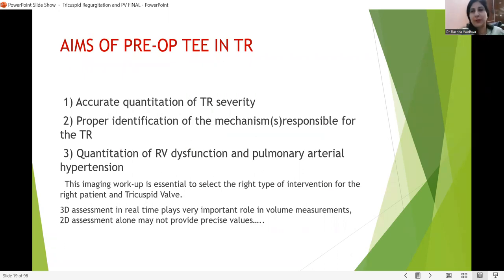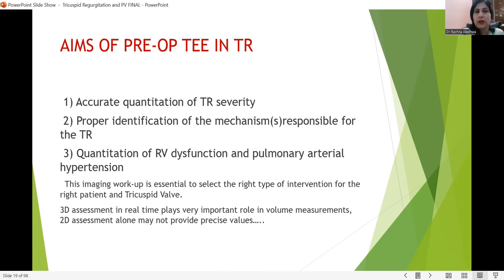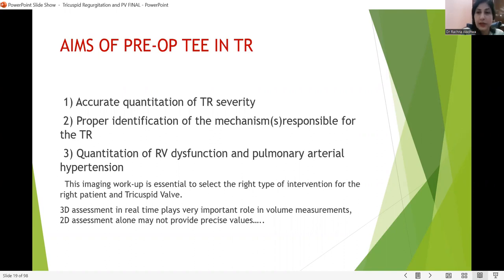When assessing the tricuspid valve, we should aim for: accurate quantification of TR severity — TR is more common than TS — proper identification of the mechanism responsible for TR, assessment of cusp morphology, quantification of RV dysfunction, and pulmonary artery hypertension. These are the three important things needed before any intervention is contemplated. In today's scenario, 3D and 4D assessment is preferred over 2D assessment alone, especially for volume measurements, as 2D gives values in only one plane and may not give a precise value.